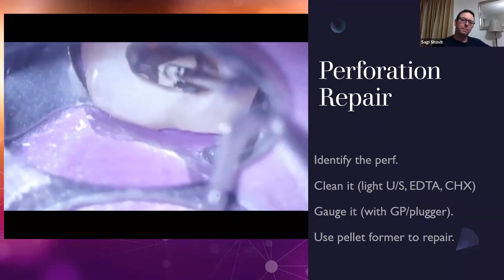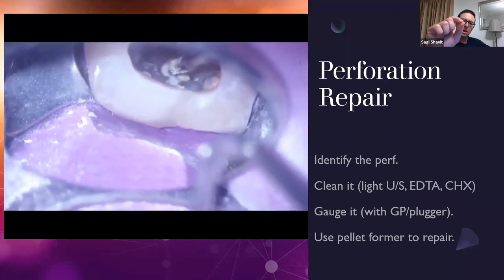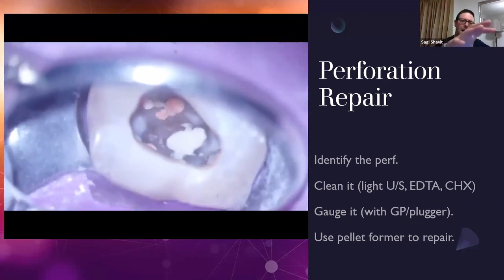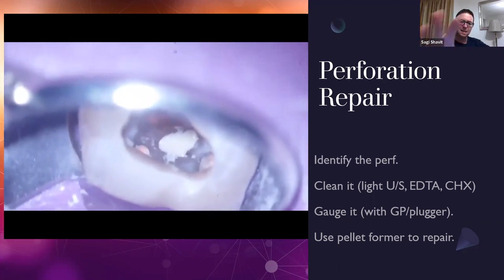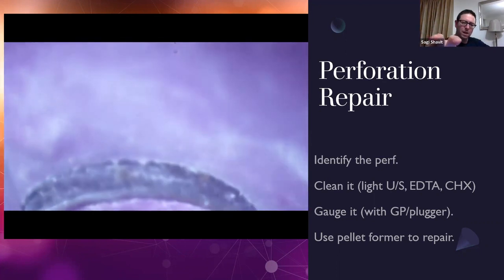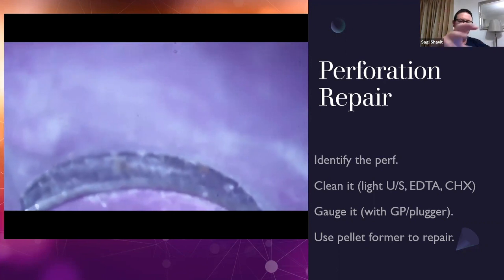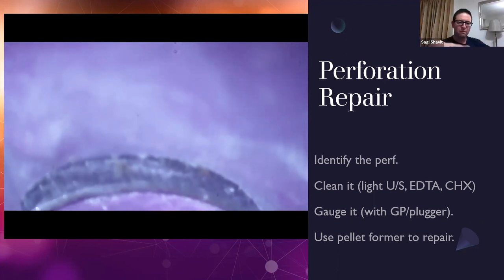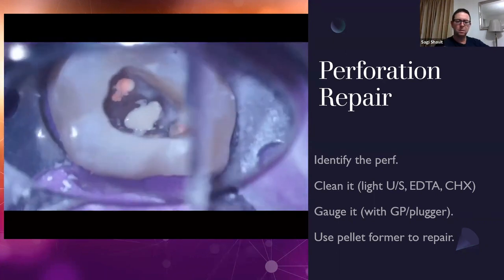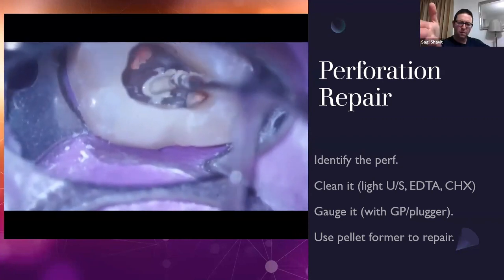Okay, now with biodentine, you can see how I do it surgically, okay? I do it not surgically, but I do it very, very accurately. I don't need to block canals. In this case, the canals were root filled already, but I don't need to block canals or anything like that. I can just do it. If you're using biodentine, you need to wait 12 minutes. If you're using the one that you use, Daniel, what's the name of it, please? One fill putty. Yeah, you can use after 3, 4 minutes, 5 minutes.